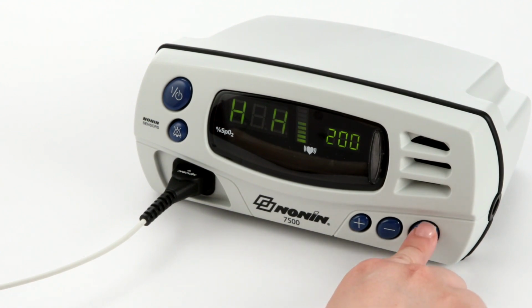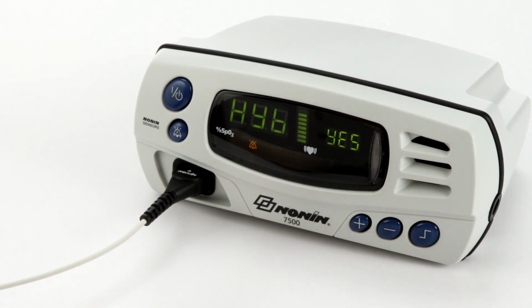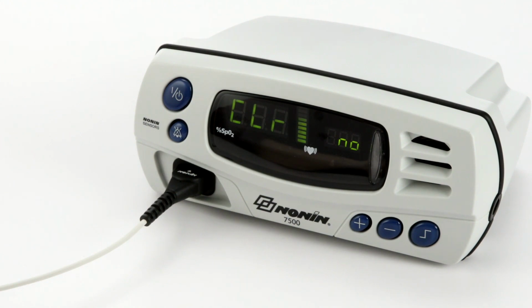To set your 7500 to hybrid averaging, press the Limits button until the display reads HYB. Press the plus or minus button until the screen reads Yes. Your device is now set to hybrid averaging mode. To save this setting, press and hold the alarm silence button while briefly pressing the Limits button. The hybrid averaging mode setting will save for future use. You will not need to reset it each time you turn the device on.